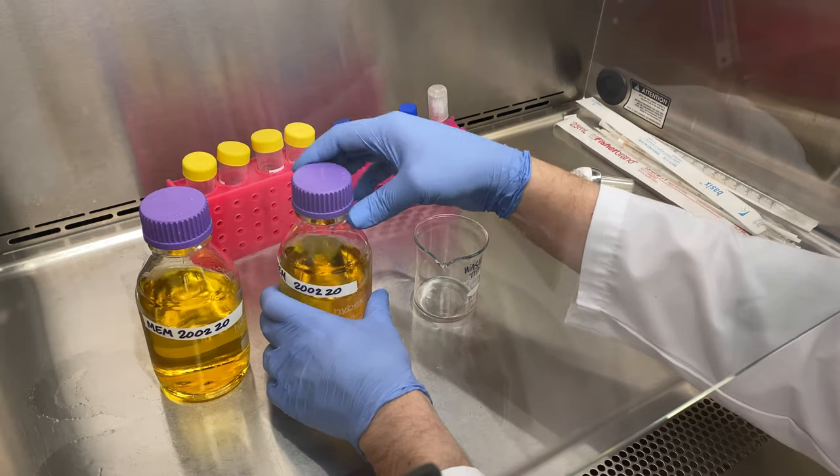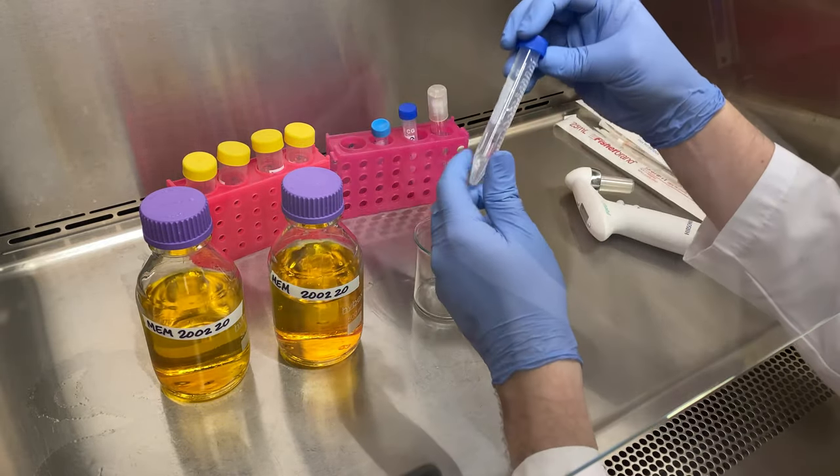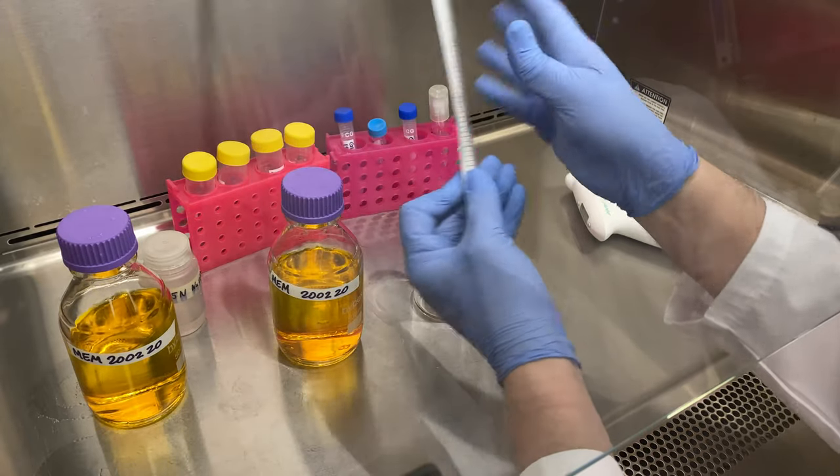This works in conjunction with our HEPES as buffering agents. Next up, we'll add our glutamine — 5 mils of glutamine to each bottle.